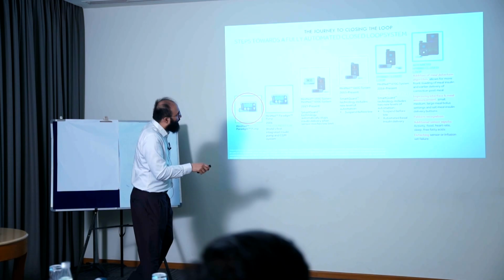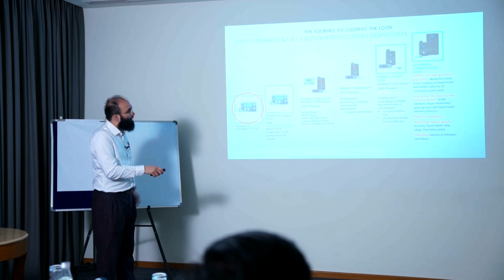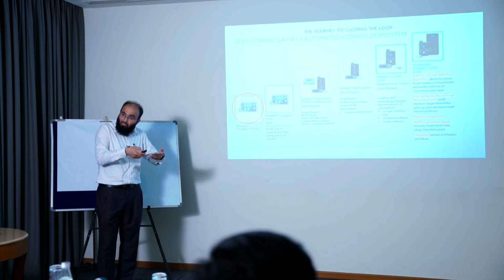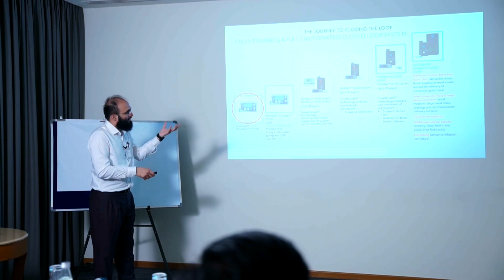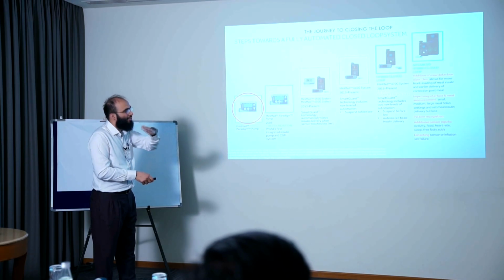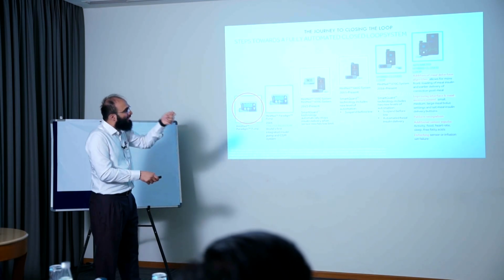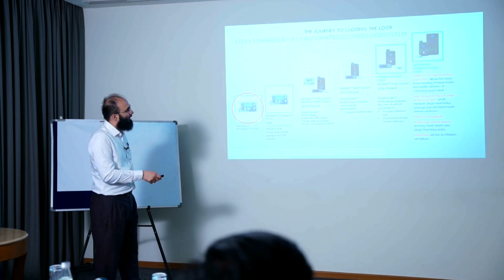Then MiniMed 640 system, 2015 to present. SmartGuard technology includes a new level of automation. This is predictive low glucose suspend, before low. Hybrid closed loop system, HCL, where SmartGuard technology includes two new levels of automation: suspend before low and automated basal insulin delivery. And advanced hybrid closed loop, addition of the meal detection algorithm allows for more front loading of meal insulin and earlier delivery of correction post meal, improving interface and meal announcement.